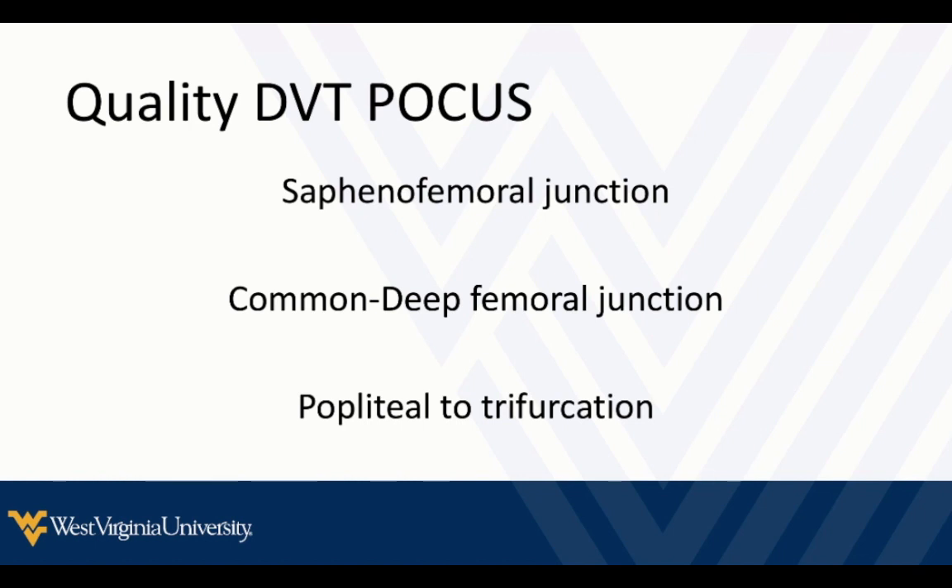Make sure you're doing a quality study. That study needs to include the sapheno-femoral junction, the common and deep femoral venous junction, and the popliteal vein — we want to find the trifurcation. I'll show you what each of those looks like.